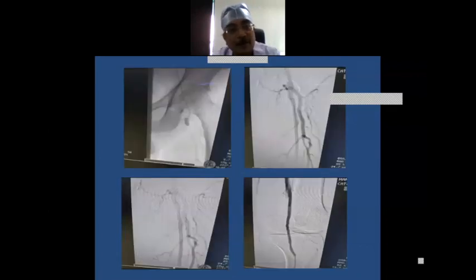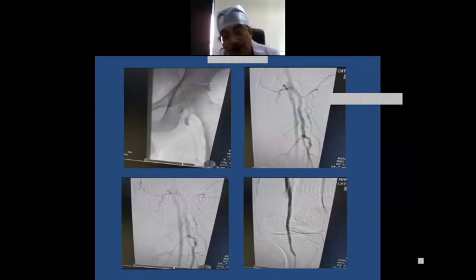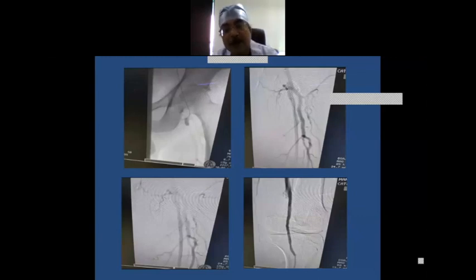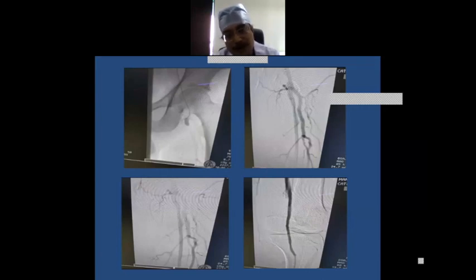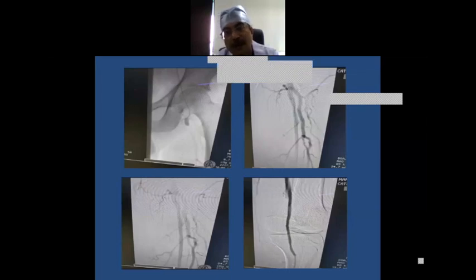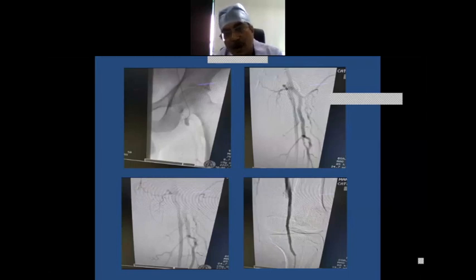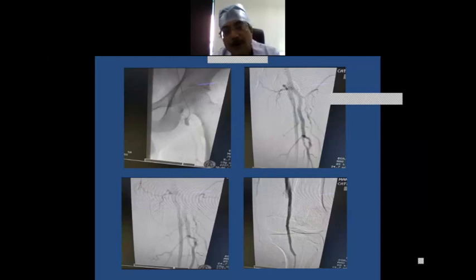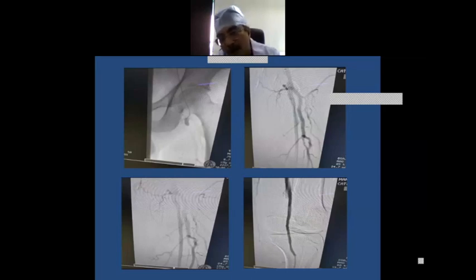In one case, we went from right to left side for an ostial occlusion of the superficial femoral artery. Once you have crossed and placed the long sheath — I usually prefer the Destination 45 cm, 6 French sheath, which is smooth and easy to cross over the aorta. Put a stiffer wire before guiding the long sheath. For crossing ostial occlusions, first decide where the superficial femoral artery starts, then use a straight or curved catheter, typically with a JT35-260 Terumo standard wire with a torquer.